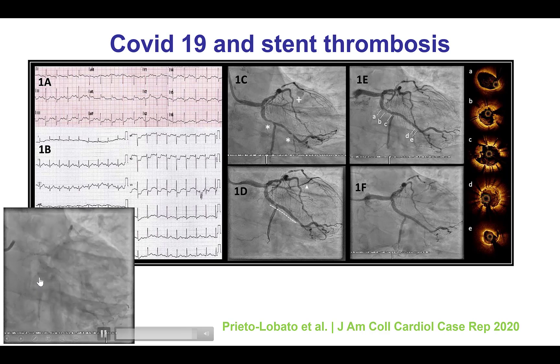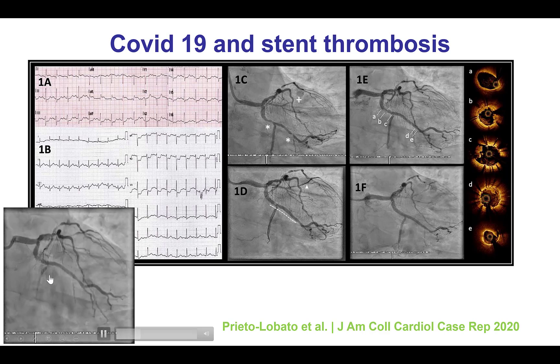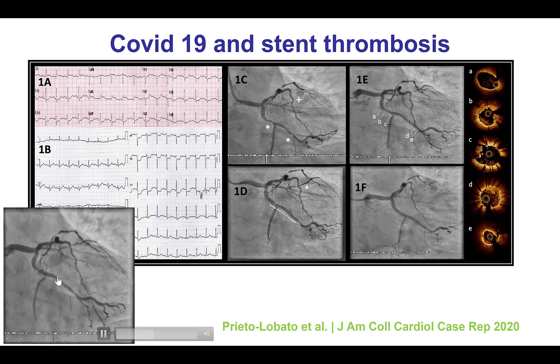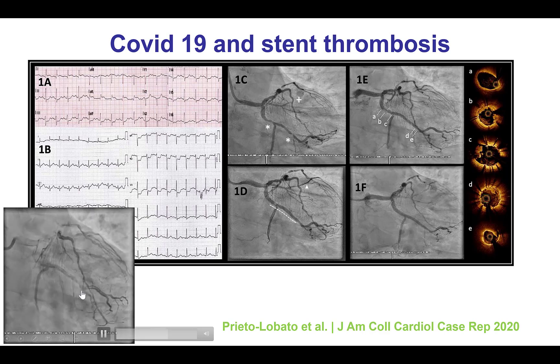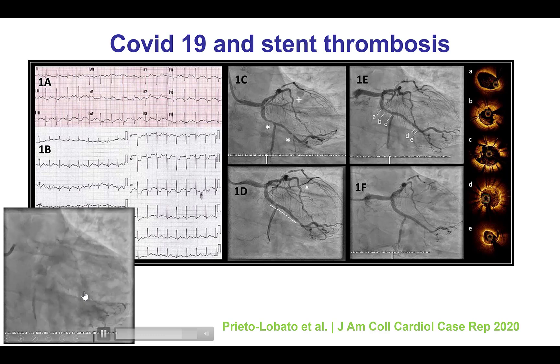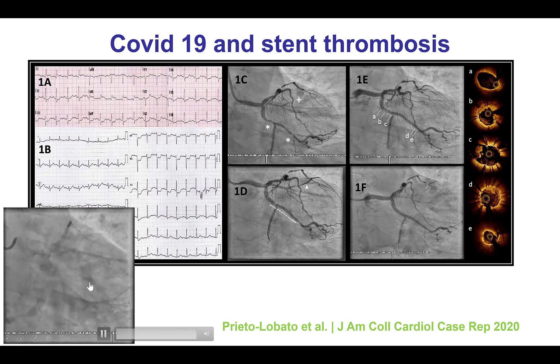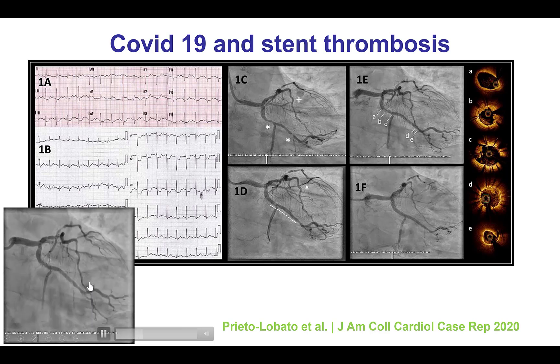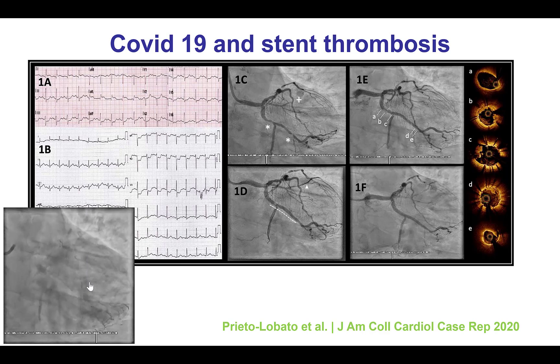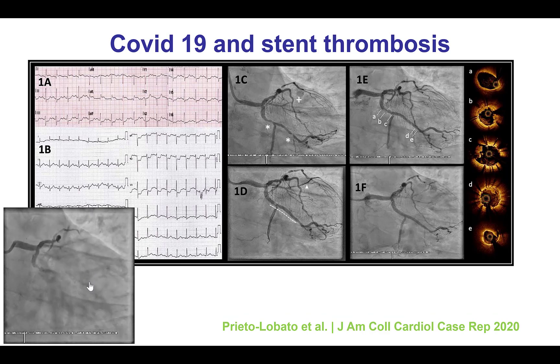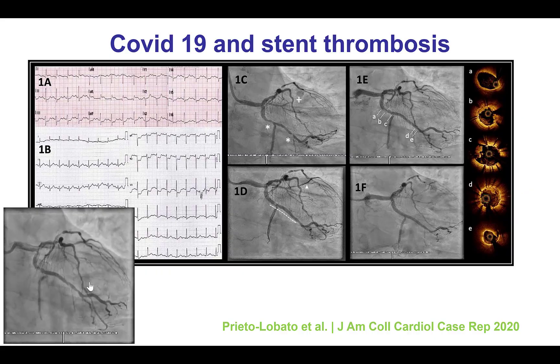This is an example of stent thrombosis in a patient who had a recent stent in the circumflex and had COVID-19 — something to always suspect. Some COVID-19 patients have had very high thrombus burden, both in the coronary and other arterial beds.